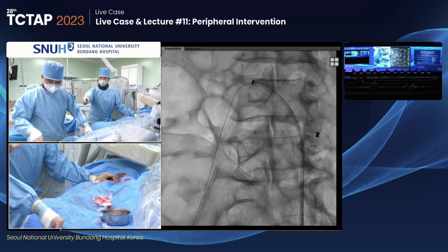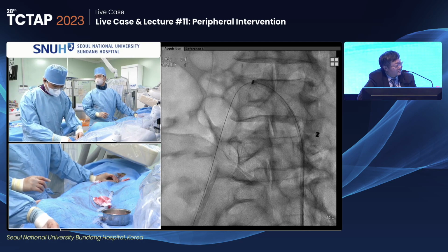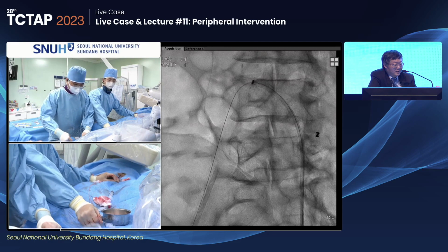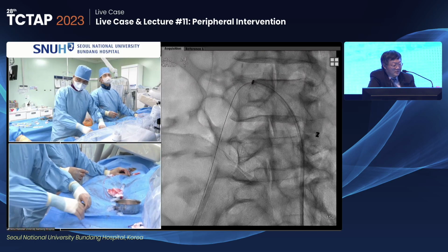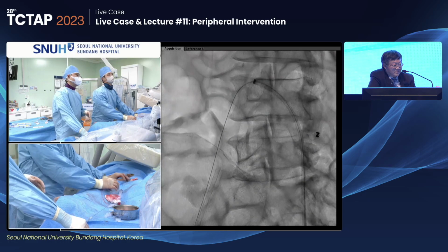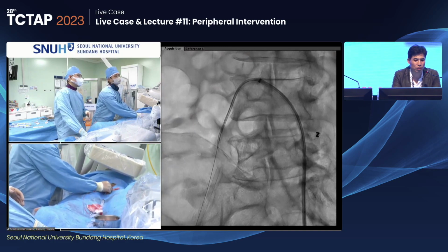So in this area, I don't know what kind of stent is more feasible, balloon expandable or self-expandable. I will insert a simple bare metal self-expandable stent. I read some articles which compare balloon expandable versus self-expandable. Because in this case the common iliac arterial stem is not so long, contralateral self-expandable stenting is a little bit dangerous.